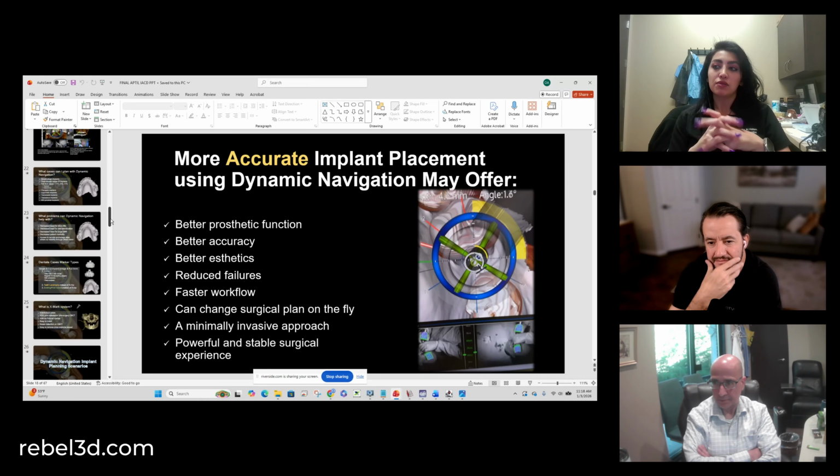The other thing is making sure that the patient's head, smile, eyes, everything is aligned in the proper dimension. So when you're taking your photos, the patient is looking straight at the camera. Sometimes, when you delegate those kinds of important pictures, your technicians or your assistants may not know exactly what you're looking for in those photos. So you are the best judge to look at those photos and determine, do I need this photo to be retaken? You don't want to wait until the patient is dismissed and then be shocked with non-diagnostic pictures for the pre-op.